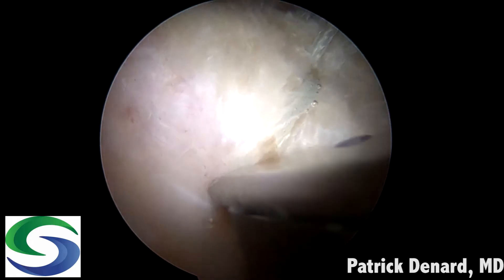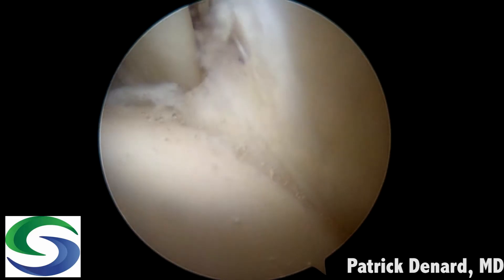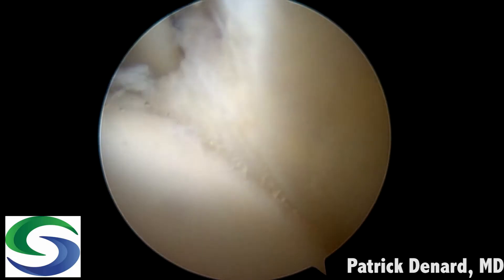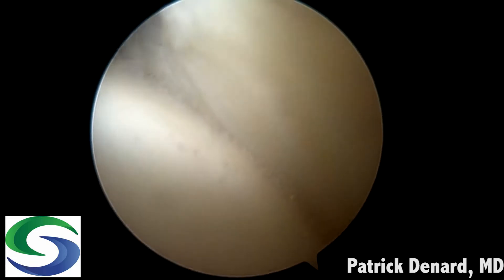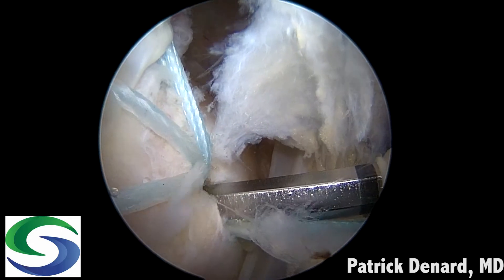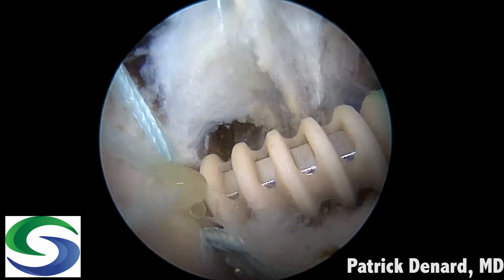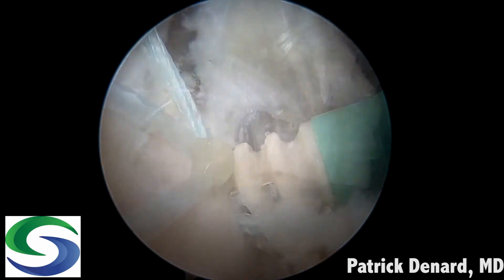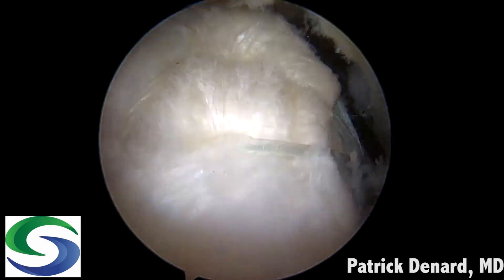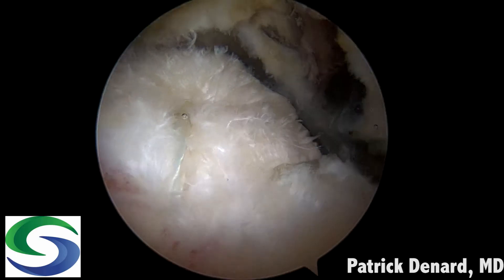We use an instrument while pulling up on the anchor to tension it, avoiding any jeopardy to the anchor. On the intra-articular view there's nice apposition of the tendon to the articular margin. These sutures are taken out to a swivel lock anchor — in this case a 4.75 PEEK anchor for this older individual, a lady in her 60s. You can see again a low-profile knotless cuff repair for a small tear with a small footprint, also amenable to double row repair given good medial-to-lateral mobility.